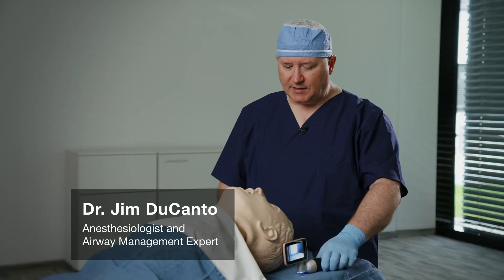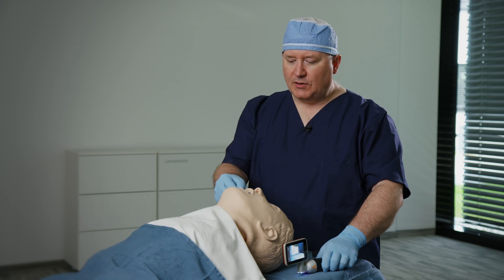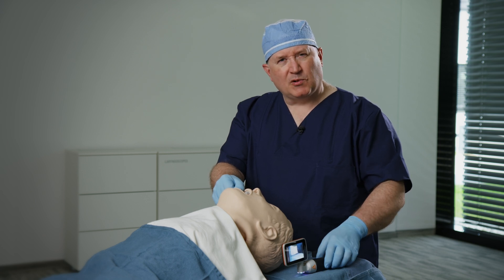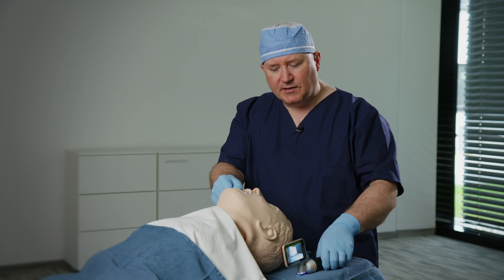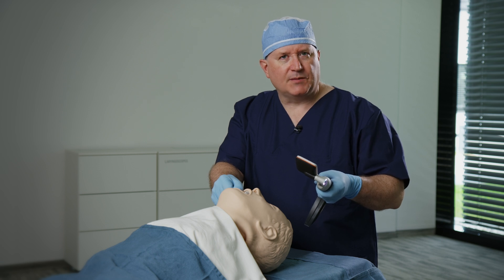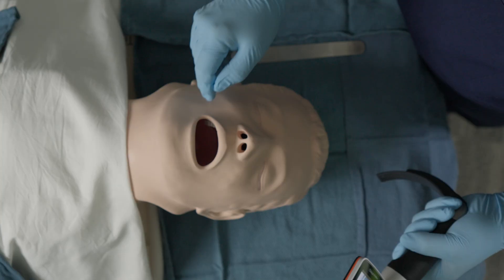Hi, it's Dr. Jim Ducanto. I'm going to be discussing a tip to facilitate the insertion of a laryngoscope. In lieu of using the standard scissor maneuver, which only really engages the upper and lower indentition and opens the mouth, it doesn't contain the tongue into the floor of the mouth, so the insertion of the laryngoscope can be hampered by an overly large tongue, either due to macroglossia or possibly conditions such as angioedema.